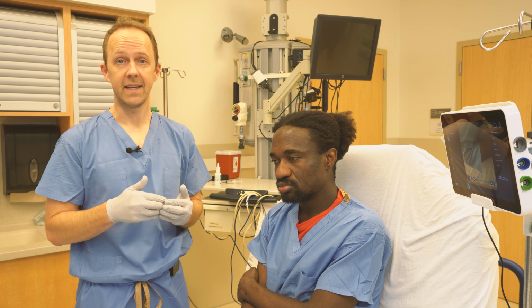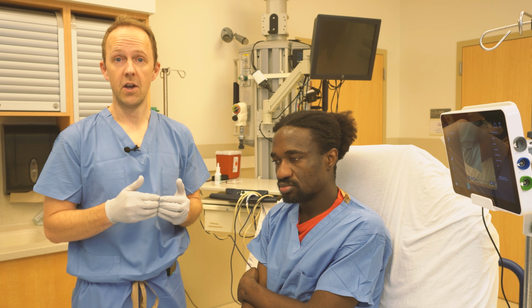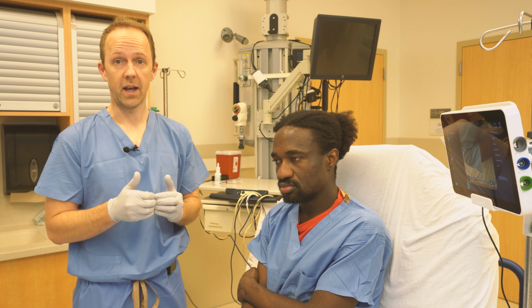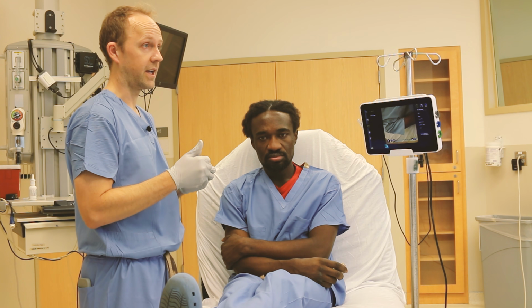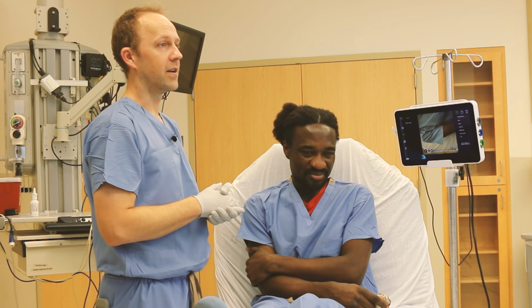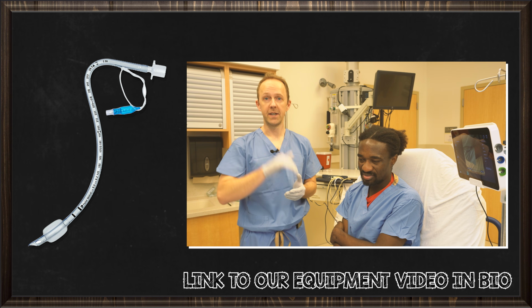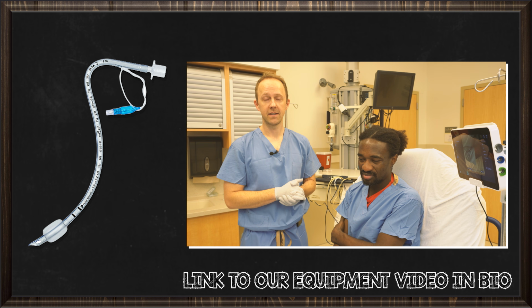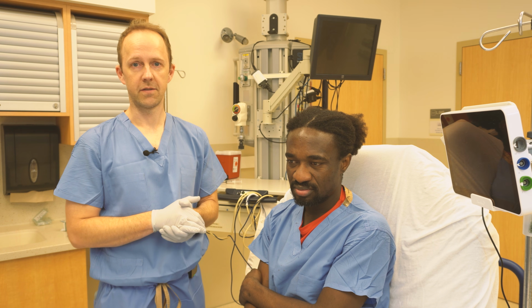We think ketamine is a bad choice for a sedative here because it often results in dissociation, where they are not protecting their airway in the same way, and they're not able to follow commands, and sometimes it can cause some increased secretions during the procedure. So some question whether we should use a special nasal tube that has a built-in permanent curve to make it easier to connect to the ventilator. And we find that harder to pass the scope through and unnecessary when you're doing this procedure for emergency patients.